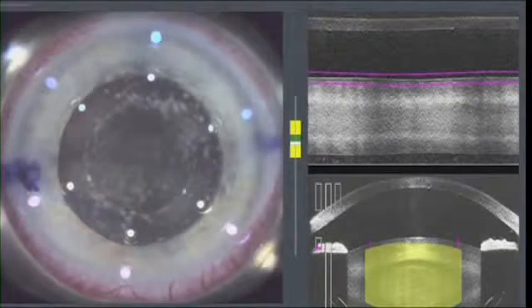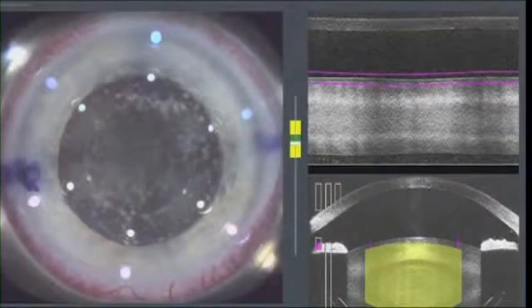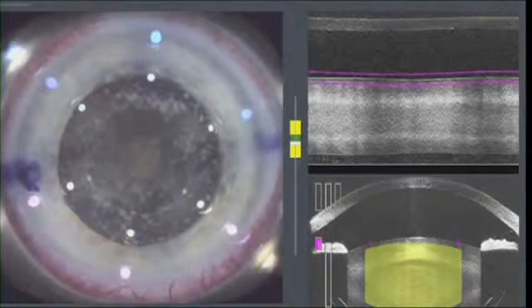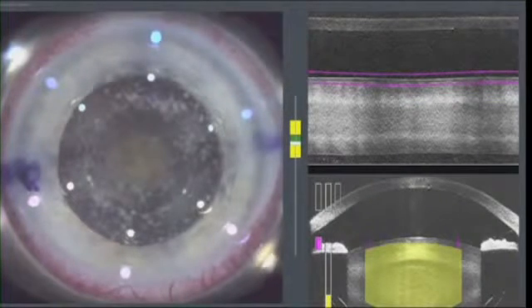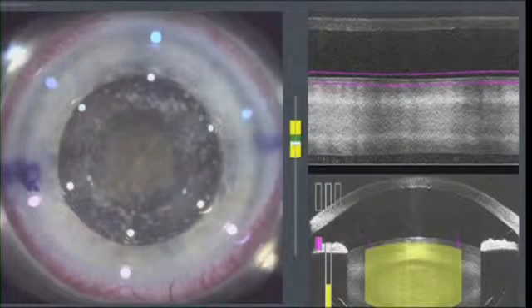Now, the laser treatment painlessly begins and takes less than a minute. You'll see bubbles. This is totally normal and partly how the laser works to accomplish its effect. First, the central opening of the cataract is accomplished.